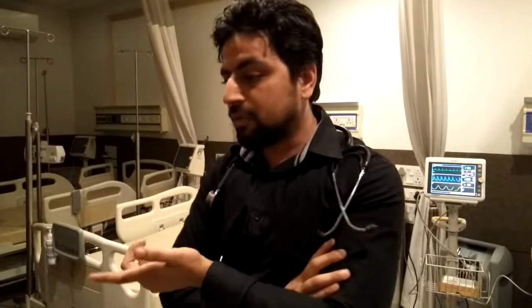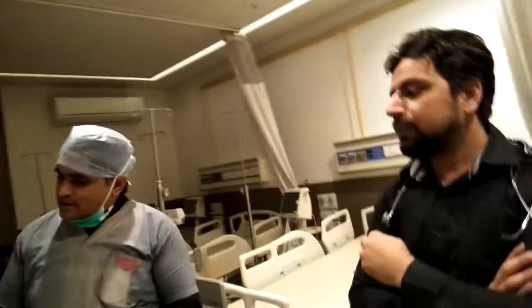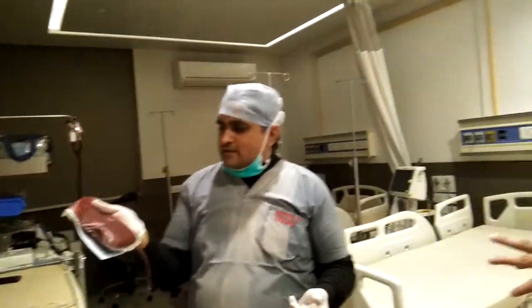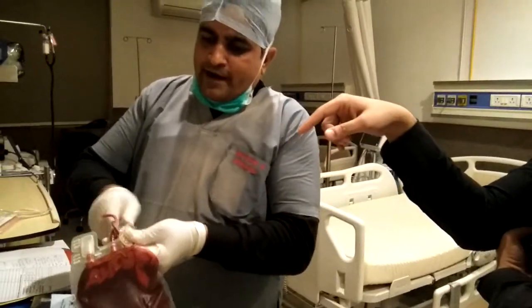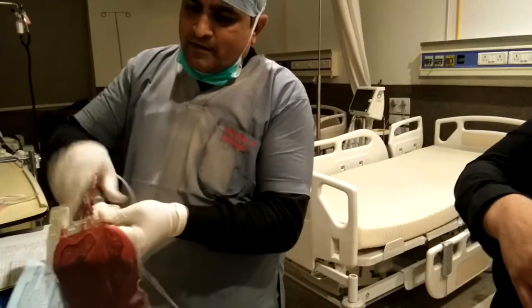We are not going to transfuse this blood very fast. We are going to transfuse this blood over nearly four to six hours, because it causes hyperkalemia — it causes high electrolyte counts. This blood we are going to transfuse for post-operative patients, those who have had major surgery. We are going to transfuse this blood for such patients in ICU.